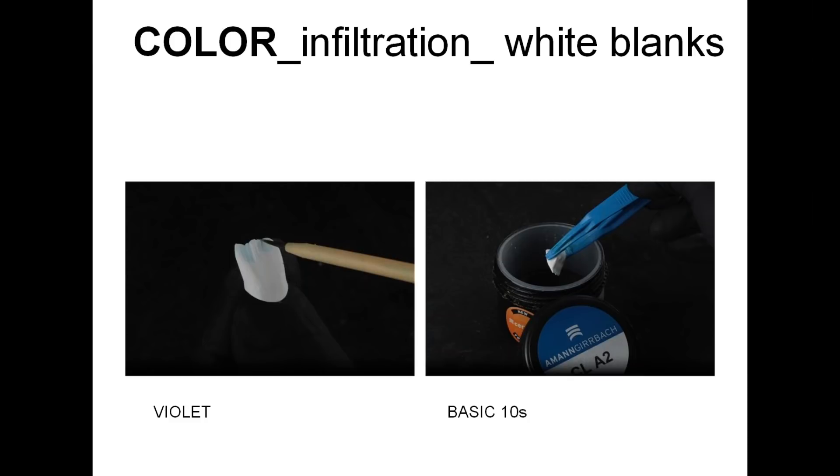Also with this step we can make a soft transition to the incisal part. Then we move on to immersion coloring — 10 seconds in 100% concentrated liquid in the matching shade. We prefer not to color the zirconia more than that, because with this procedure we have control, and we like to individualize crowns with stains and ceramics later on.